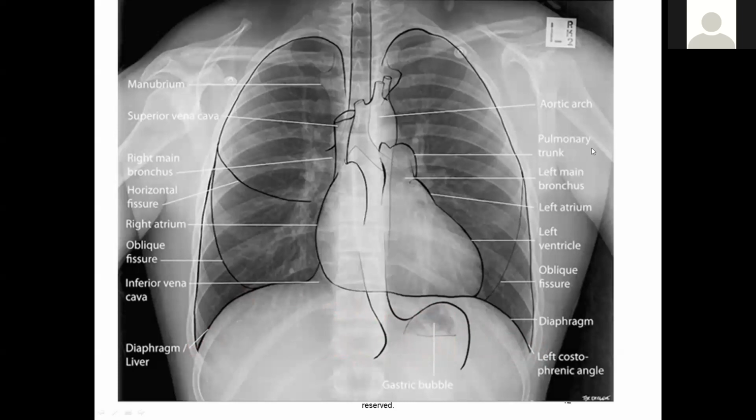Get used to looking at x-rays from this perspective. Now, we take chest x-rays with the patient facing our wall stand. So if you were facing the wall or facing a closet door, x-rays enter from the back and exit the front. But that's not how we display them for the radiologist to read or on our monitors when we are reviewing our work.